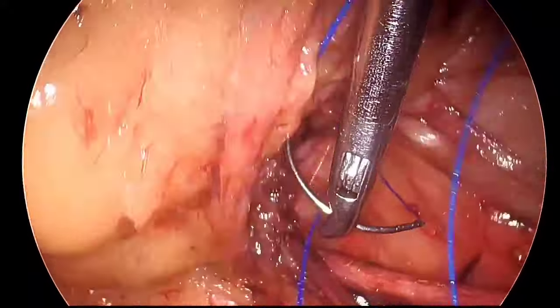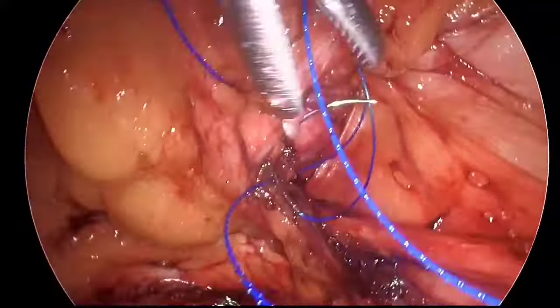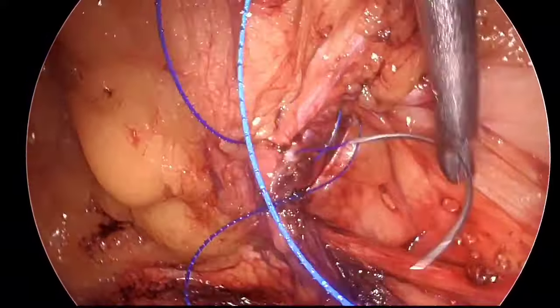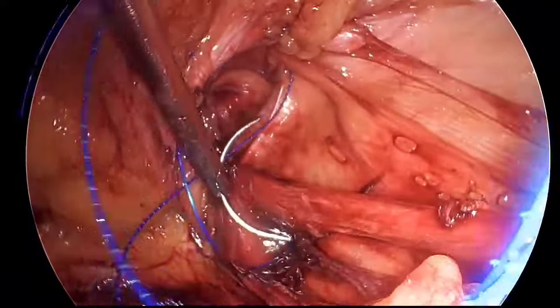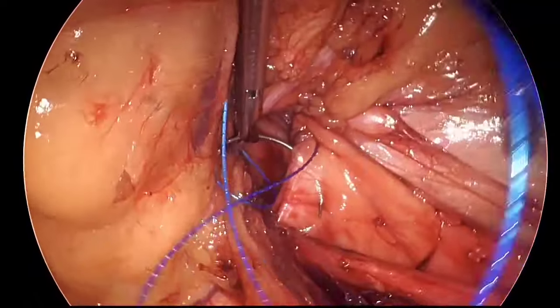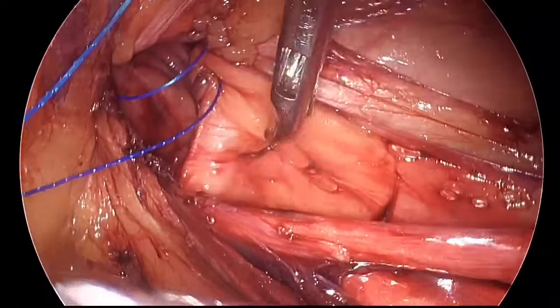It's like an iliopubic tract repair that we do in pediatric hernias, where I take bites from the arch fibers, the hernial sac area and the iliopubic tract.